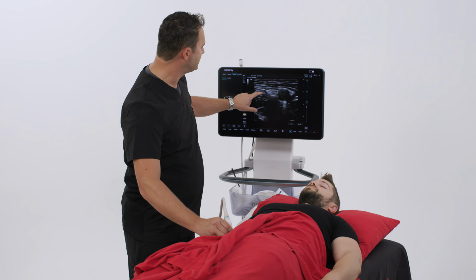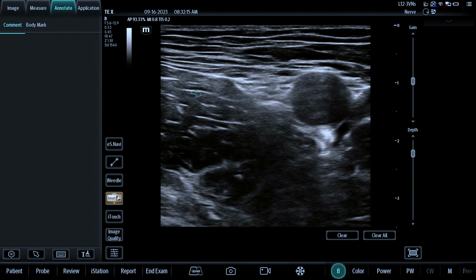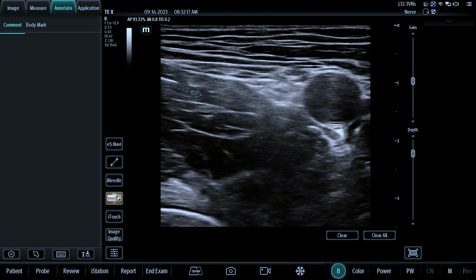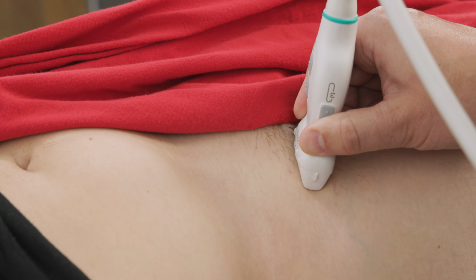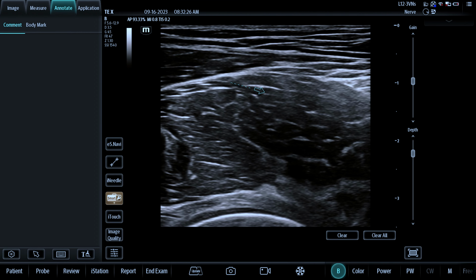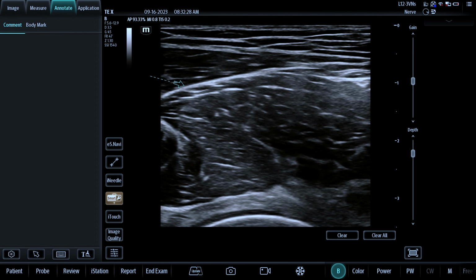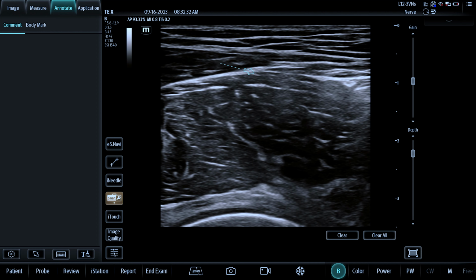This is our home base for doing a fascia iliaca. You want to start here, find the femoral artery, femoral nerve. As you're in the inguinal crease, you want to move laterally until you start seeing the sartorius muscle. And this is the sartorius muscle here. Again, this is the iliacus muscle, and you can see our nice fascia iliaca plane going right here.